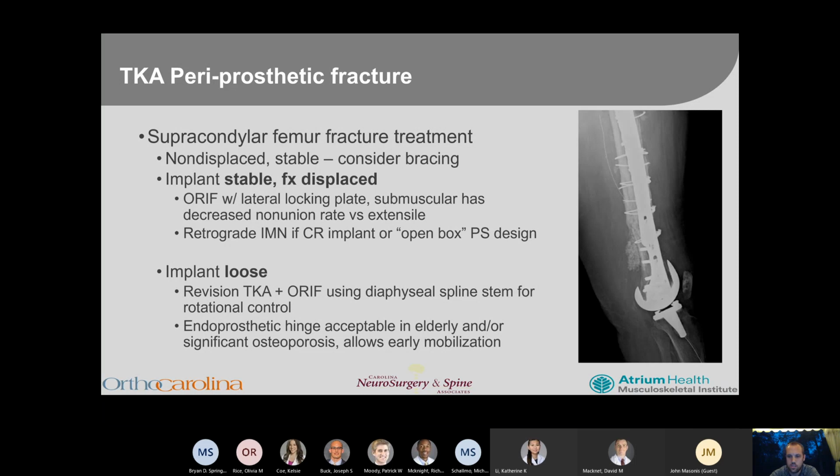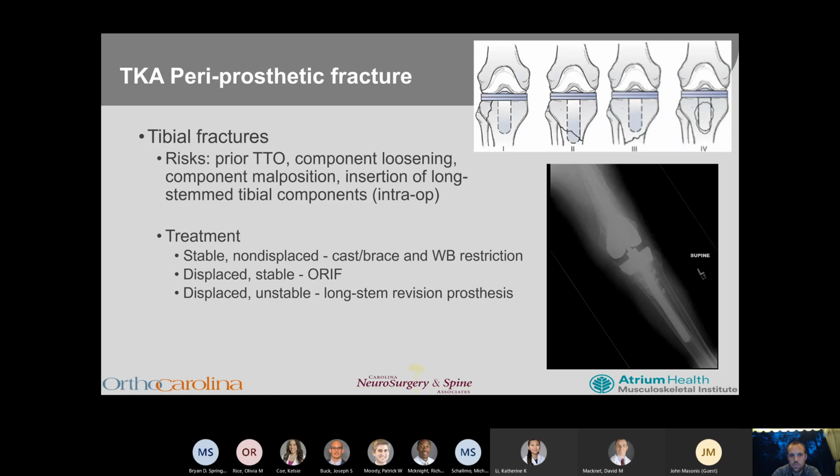or a rotating prosthesis, and that's going to be a larger prosthesis which extends further up into the femur, and really should only be used for severe comminuted fractures with really poor bone quality. Generally on the test, if there's any way to fix it, that's the direction they're going to push you.